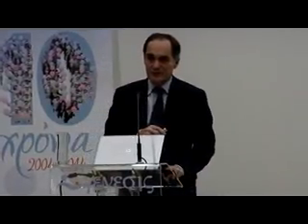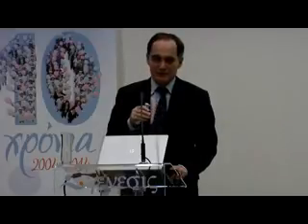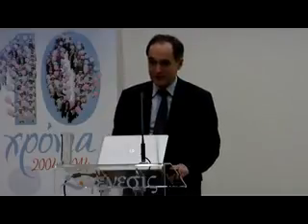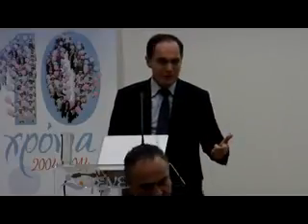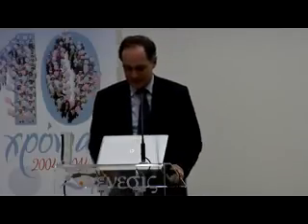And when you take it out, it does not bleed. We do not really understand why it does not bleed, because it does not bleed with fluid, it does not bleed if we lower the pressure, so it is a really atraumatic biopsy. And they use it for heart biopsies, for bone biopsies, and for breast biopsies, and it is a very, very interesting technique.